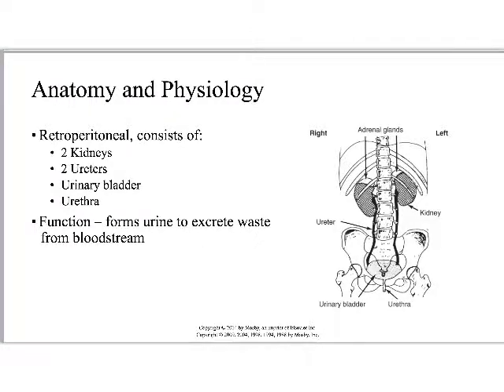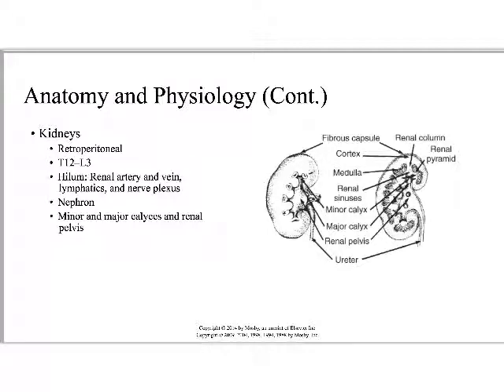To understand that functional aspect of the kidneys, we kind of have to zoom in. This is what I'm talking about, being familiar with this kind of zoomed-in functional anatomy of each one of these little funny bean-shaped organs, even though they don't show very well on a KUB, right? And you may struggle to identify them on those images. That's okay. You need to be familiar with each part of this slide, as well as, I think it's helpful, the little illustration on page 213. I couldn't find a good version of this to put into the PowerPoints, but this is an important illustration.